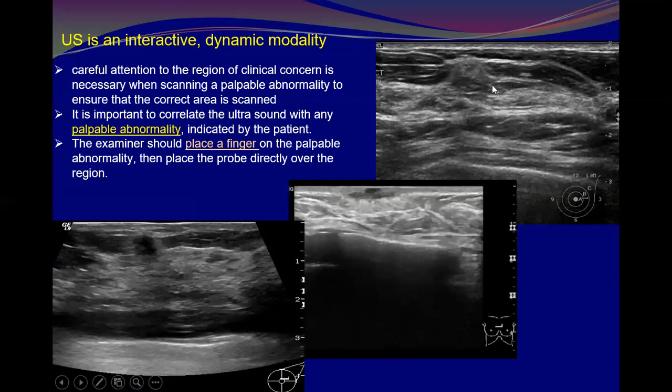This is only a fibrous ridge, a fibrotic part of the parenchyma tenting and pulling the superficial layer of the superficial fascia, and it becomes discernible, like a discernible mass.